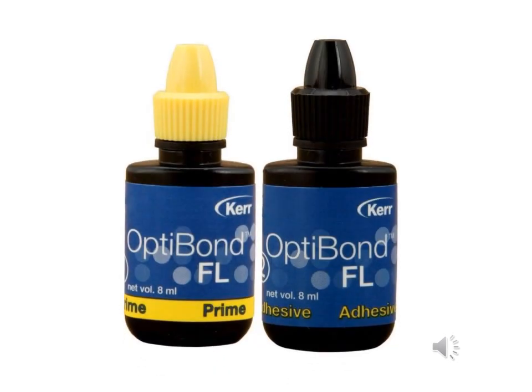Here in this picture, the adhesive is alone in one bottle and the primer in another bottle. As you see in this, which is the OptiBond, الادهيزف بواحد والبرايمر بواحد. نعمل application للبرايمر, then we applied the adhesive.